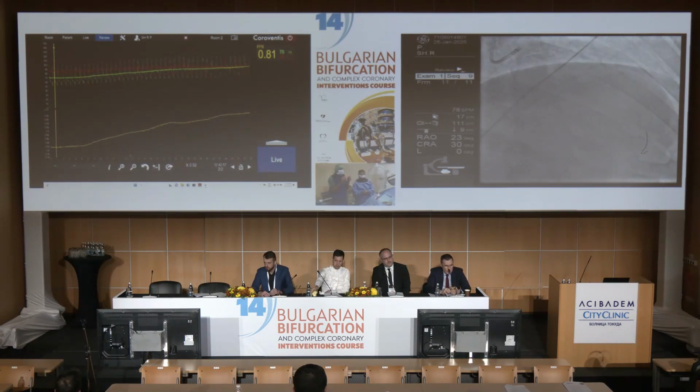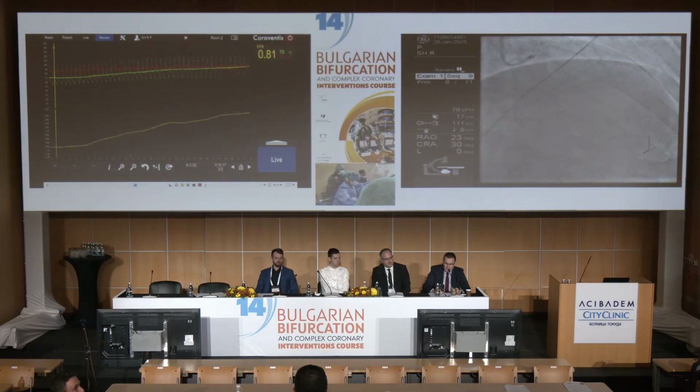We are going to take advantage to perform two things, and to try to demonstrate two things. First, bolus thermodilution. Are we ready with bolus thermodilution? And continuous thermodilution. These are two applications of the general indicator dilution theory, but you will see they are quite different. They provide us with some different approaches, but I believe that both are complementary and that the future is in these measurements based on the Abbott pressure/temperature wire.